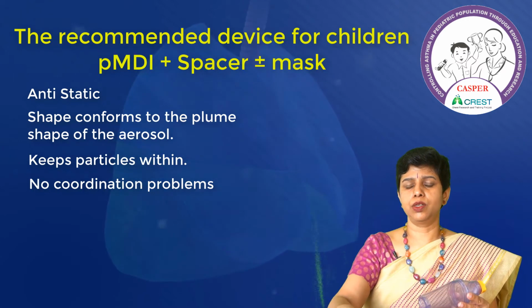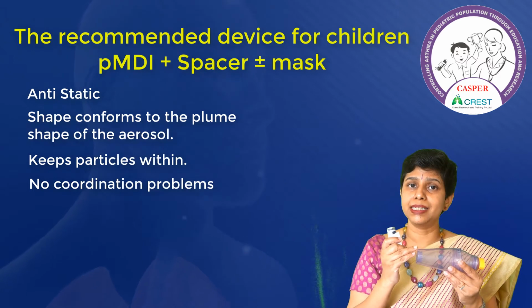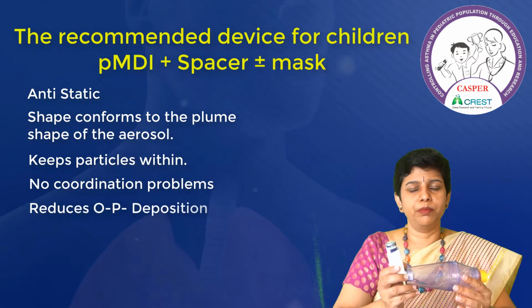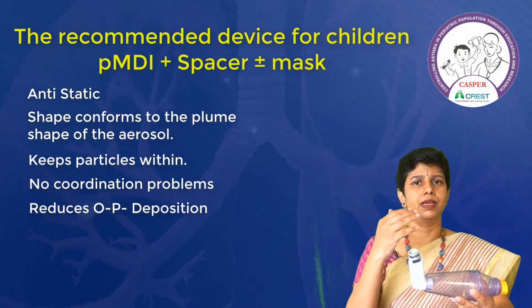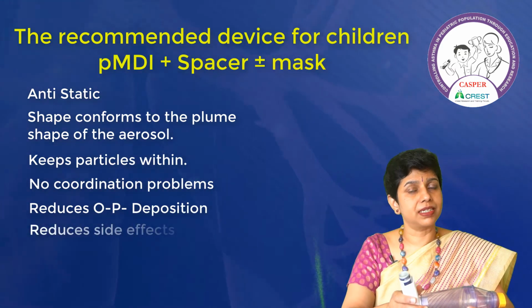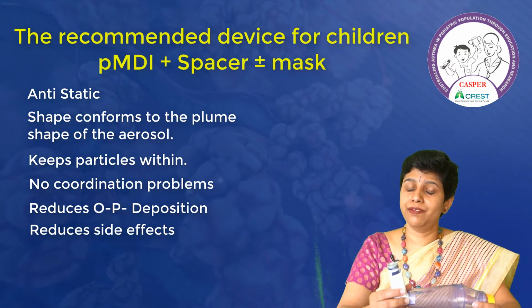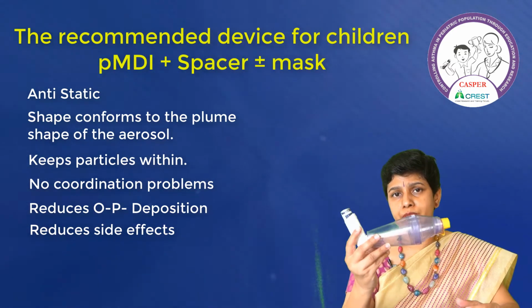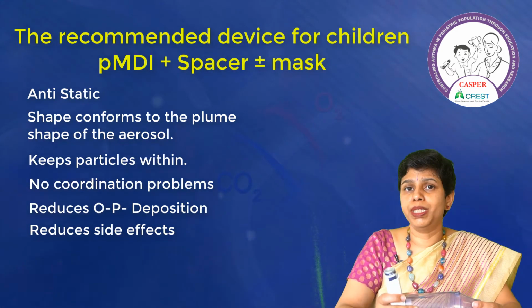Because it is not going directly and hitting the oropharynx, there is lesser oropharyngeal deposition. Because there is lesser oropharyngeal deposition, there are also lesser side effects associated when we are using an MDI with spacer.